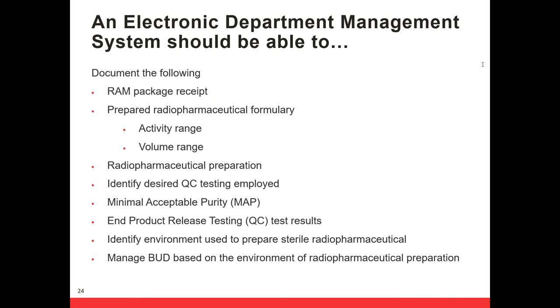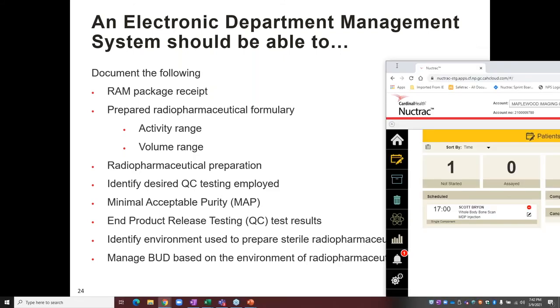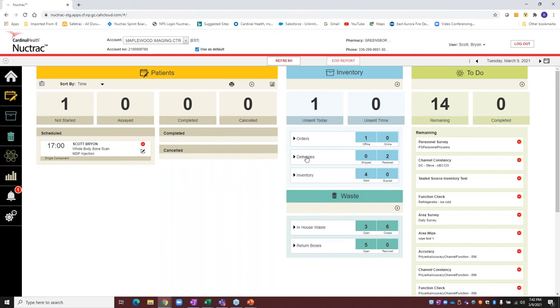And then of course, we want to be able to give you some of the other items that are associated with it. Probably the big one around that is, what if you are using an SRPA or a clean room suite? Maybe you don't have the minimum 1 hour immediate use requirement. So we're going to go through some of that stuff too. And I can show you in an application. Let's drag it over onto my screen, and we'll walk you through what I think these things should be.